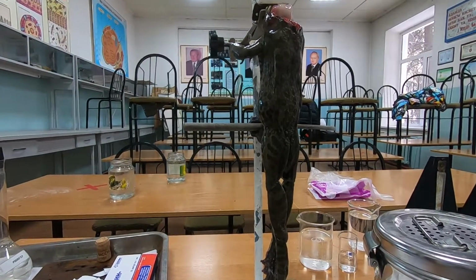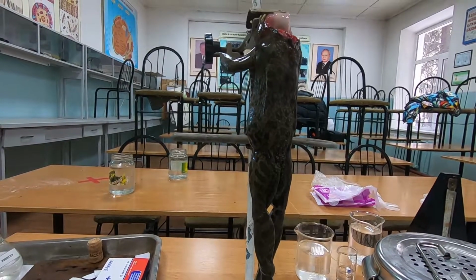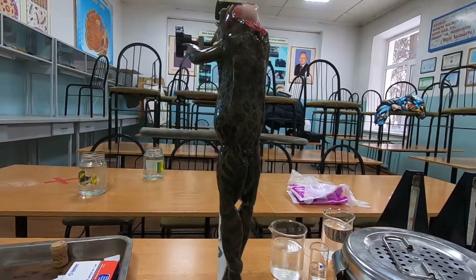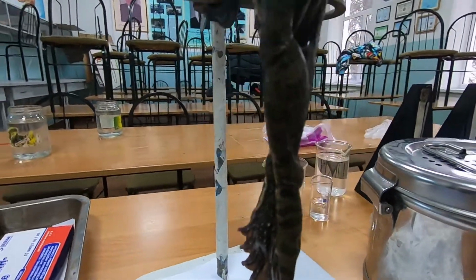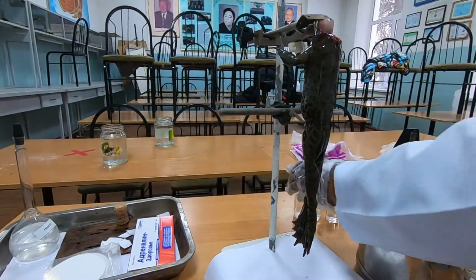So when you add more concentration, when we apply 1% again, it will take longer for the reflex to take place. Because the body gets used to the whole system. That's how it works. Okay? So, thank you. We're going to wash it.